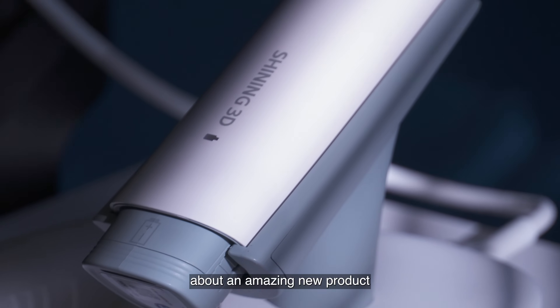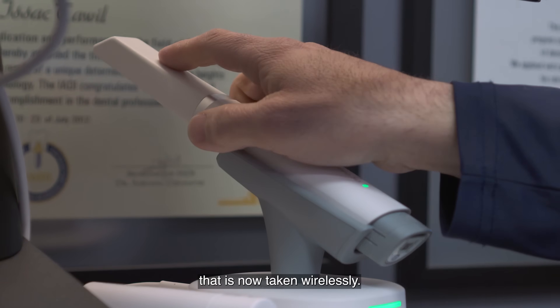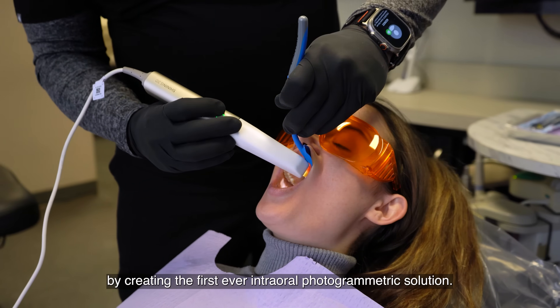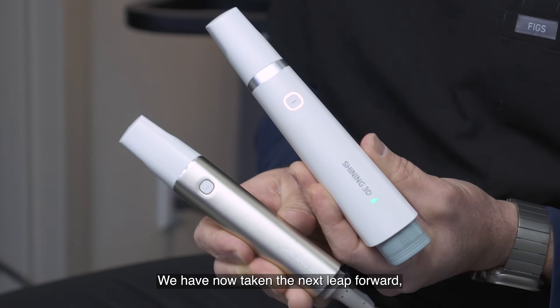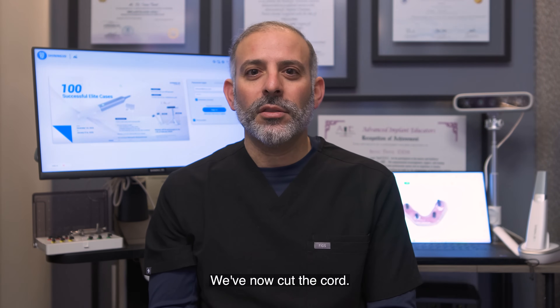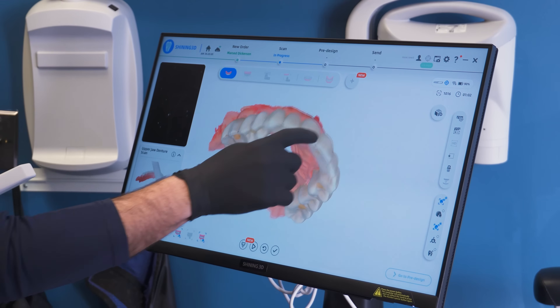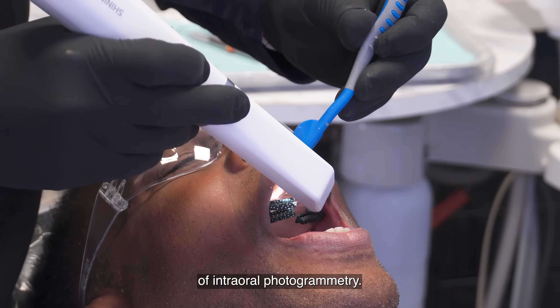We're going to be talking today about an amazing new product that is now taken wirelessly. After building up on our first innovation into photogrammetry by creating the first ever intraoral photogrammetric solution, we have now taken the next leap forward — something that no other company has been able to do. We've now cut the cord.